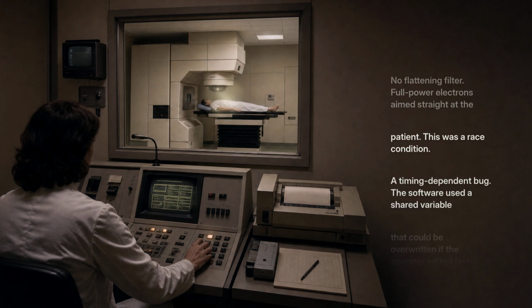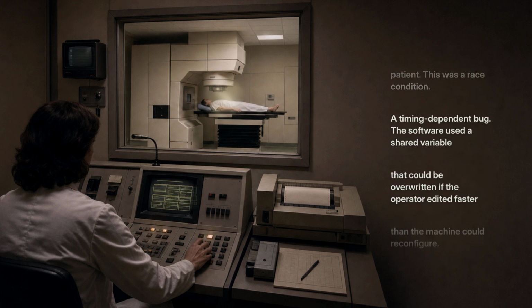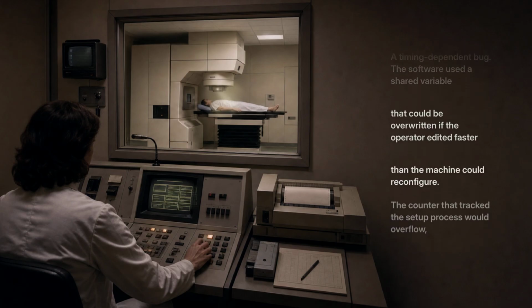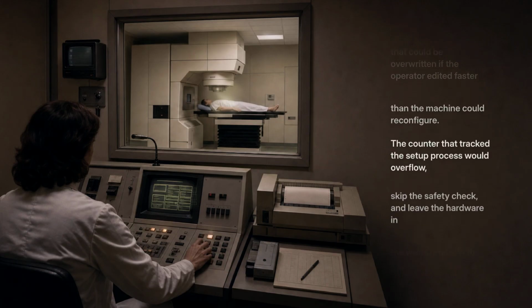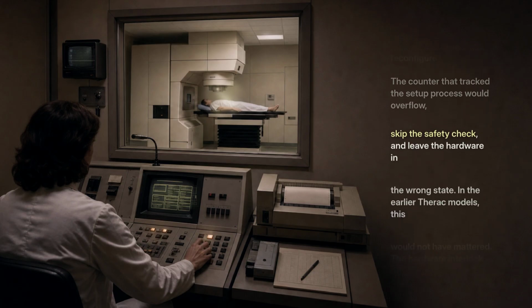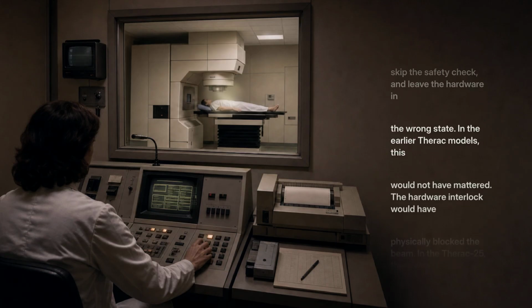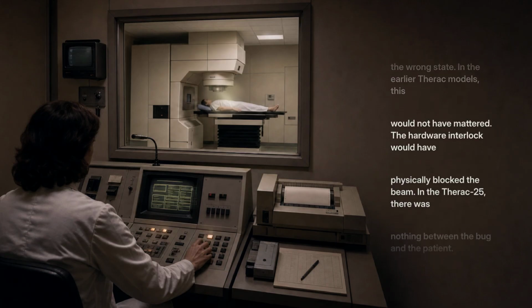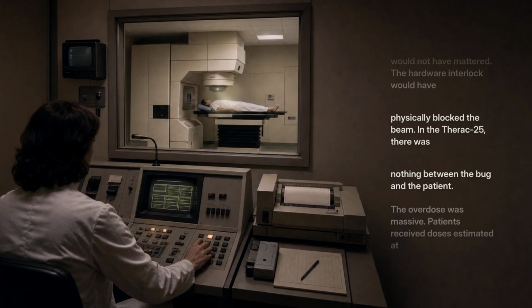This was a race condition, a timing-dependent bug. The software used a shared variable that could be overwritten if the operator edited faster than the machine could reconfigure. The counter that tracked the setup process would overflow, skip the safety check, and leave the hardware in the wrong state. In the earlier Therac models, this would not have mattered. The hardware interlock would have physically blocked the beam. In the Therac 25, there was nothing between the bug and the patient.